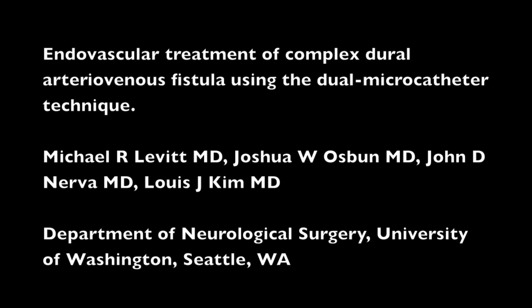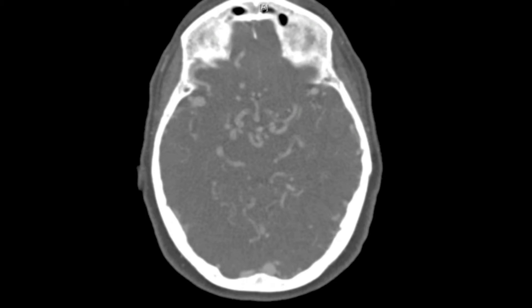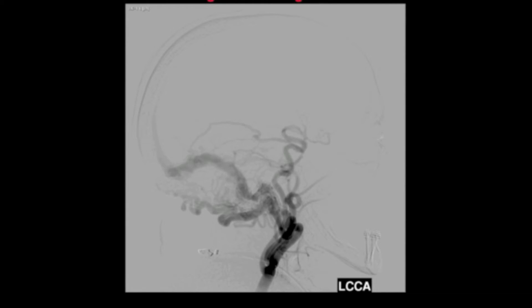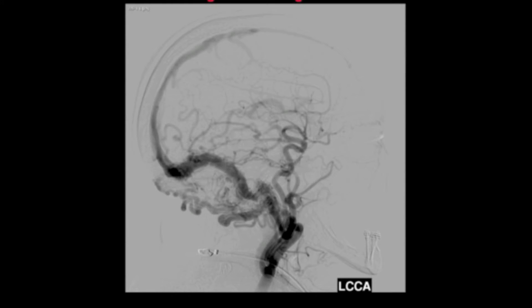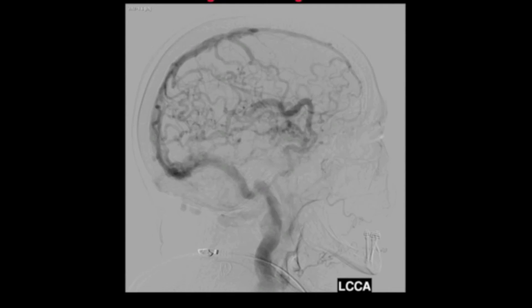This video will discuss the endovascular treatment of a complex dural arterial venous fistula. A 71-year-old woman presented with headaches, and a CTA showed multiple dilated intracranial vessels. Cerebral angiography demonstrates a complex dural arterial venous fistula with multiple feeders from the left internal and external carotid artery.